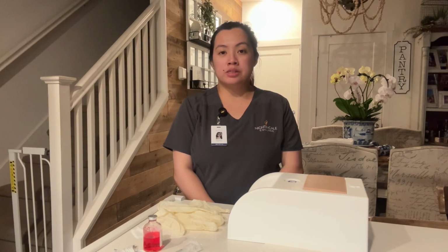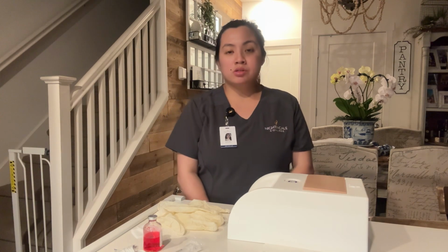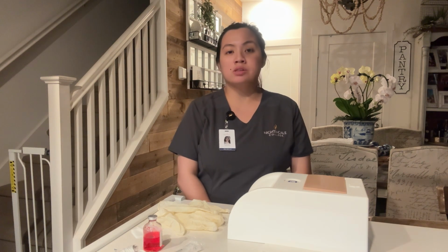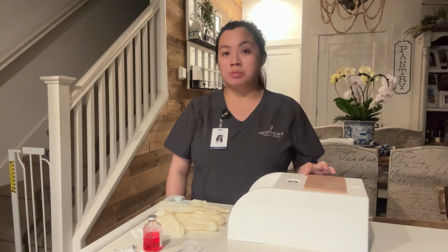Hi, I'm Kathy Porras, and I will be demonstrating how to administer a subcutaneous injection. I will gather my supplies.